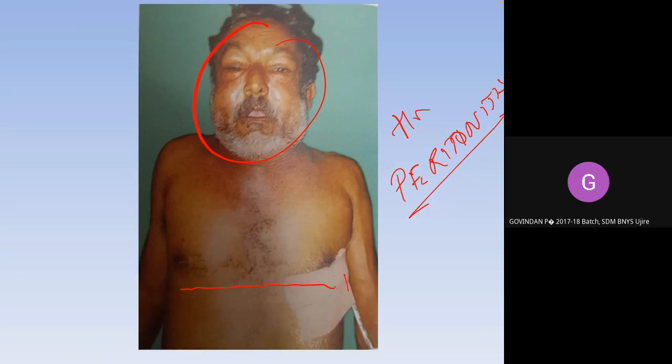Here they have put a tube. What is this tube? I told you about this tube, to the chest they have put. ICD. Okay, this is an intercostal drainage tube. Probably this is a patient who has been hit or has fallen, and there is pneumothorax or a hemothorax, and they have put an ICD, and the abdomen is also having a perforation. So his face is like a Hippocratic face. Hippocratic facies is like death-like facies, deathbed-like facies.